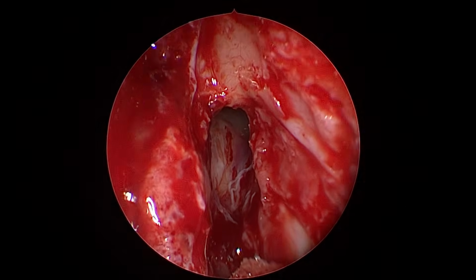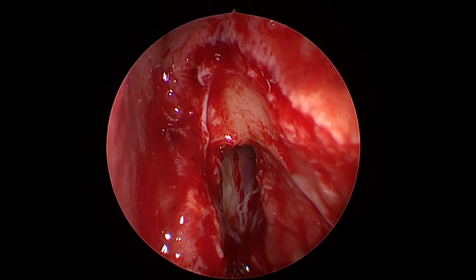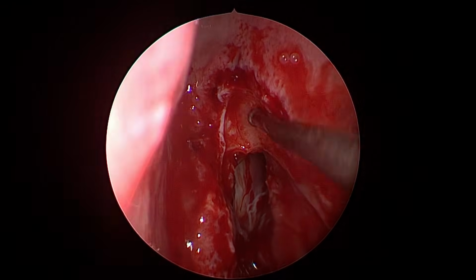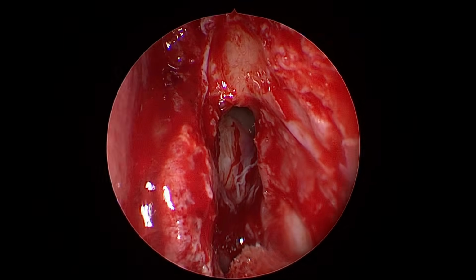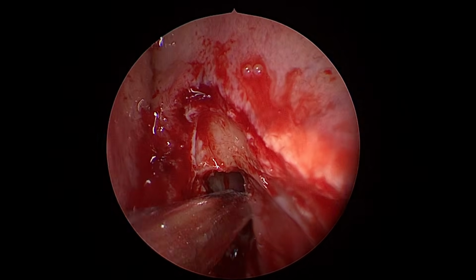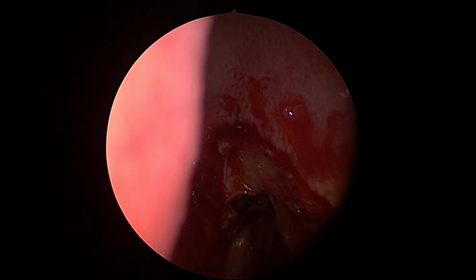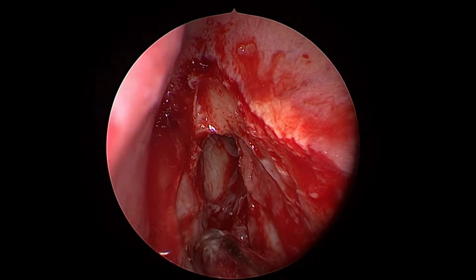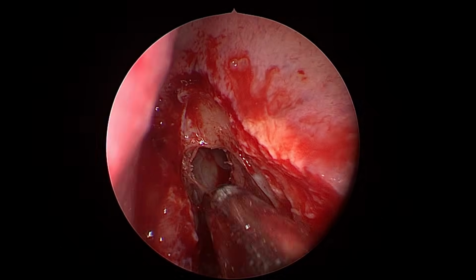Now suppose you are still not getting adequate access. This beak is the culprit, I told you, coming in the way. Drill away this beak. This will be like opening the book. That is Draf, who has devised a variety of procedures. At the end of the surgery, our goal is to give good access to the topical steroid. If you open a narrow frontal that is not adequate enough to deliver the topical steroid, that is no fun for the patient.